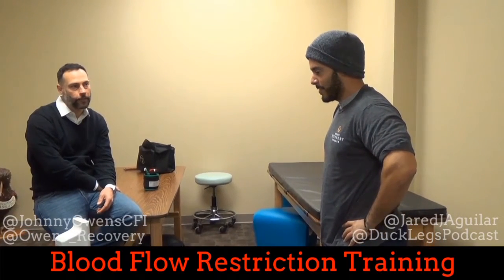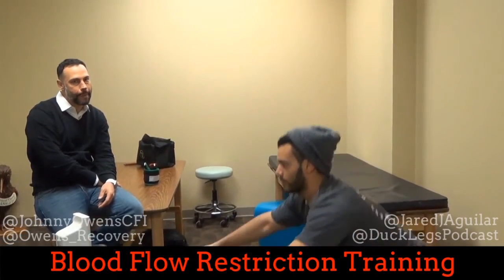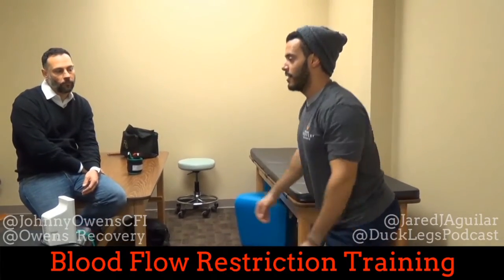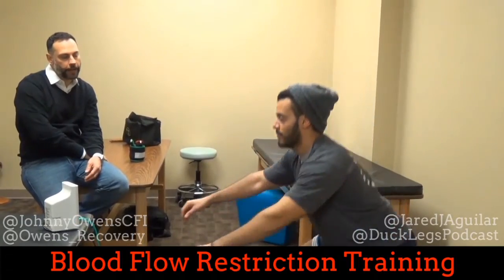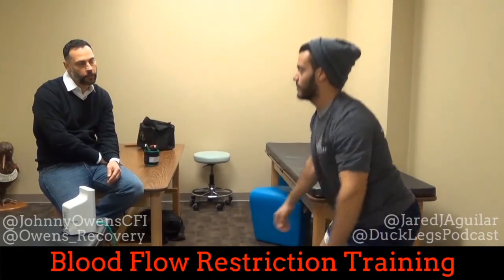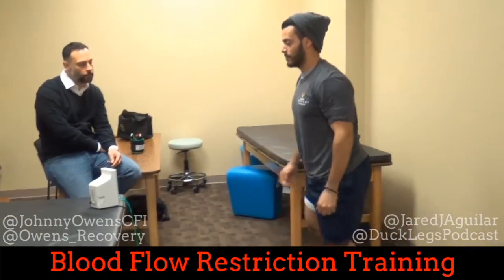Five more seconds and you do another 15. Jared is no stranger to working out — he's had plenty of weight on his back before. It's very interesting to see him breathing like this working with just body weight. In later phases of rehab, where patients are getting beyond their injury, we would be loading — more at a 20 to 30 percent load. But this is early phase rehab — no load at all other than body weight.